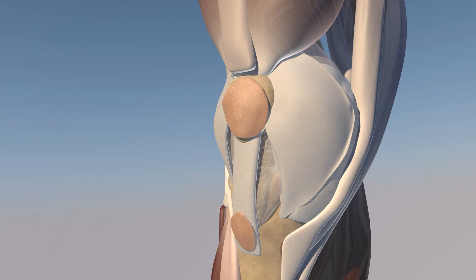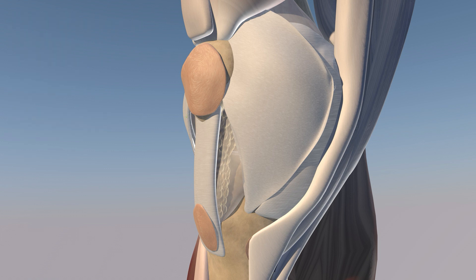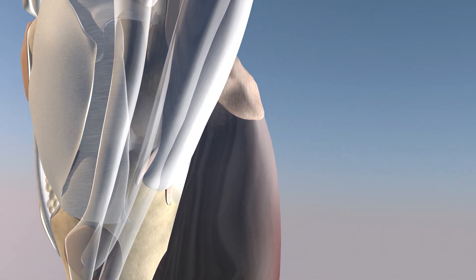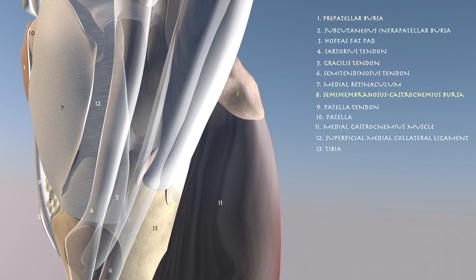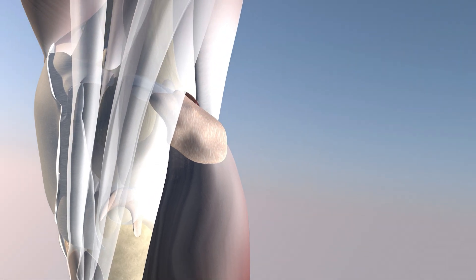Here we're going to go over some of the bursae of the knee. We can see the prepatellar bursa and also the subcutaneous infrapatellar bursa. We can also appreciate Hoffa's fat pad, the knee capsule, and the medial retinaculum. Here on the medial aspect of the knee, we can see the pes tendons inserting on the proximal medial tibia with the pes bursa underneath.